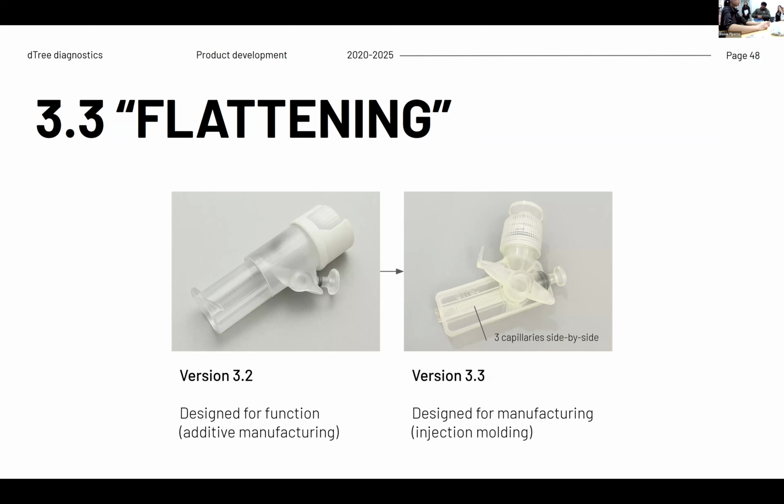Yeah, but I just wanted to share the whole design iteration and that it's not like we woke up one night and said, oh, this is the one. There are various ones that we tried. These are the larger valves that we also tried. We initially started with the basic PLA based printing. So this is like, how do you do a plunger in a plunger if you don't accidentally push the other side?